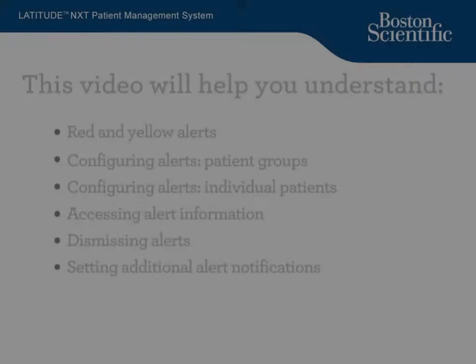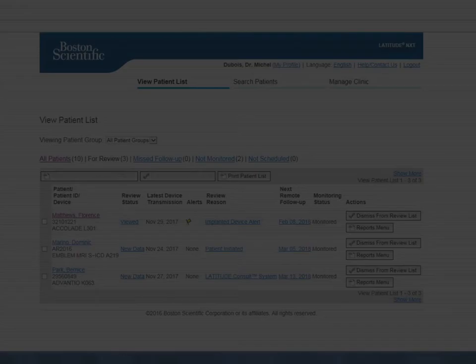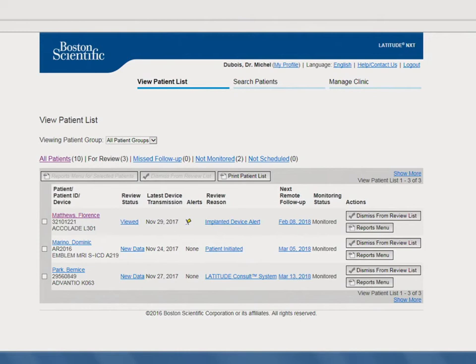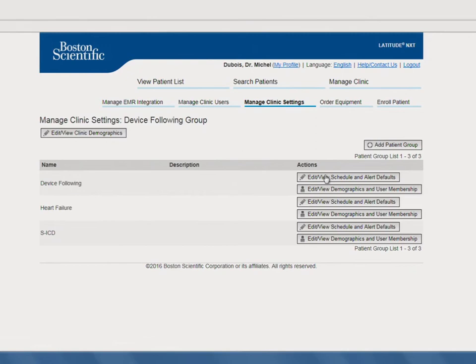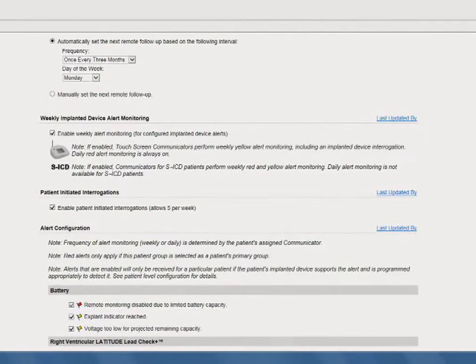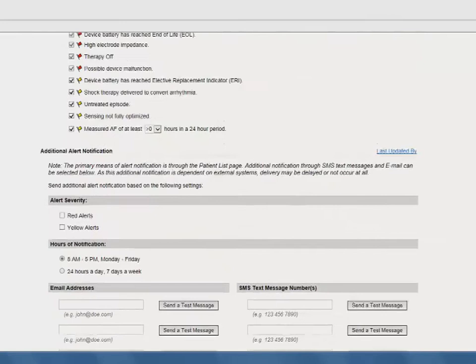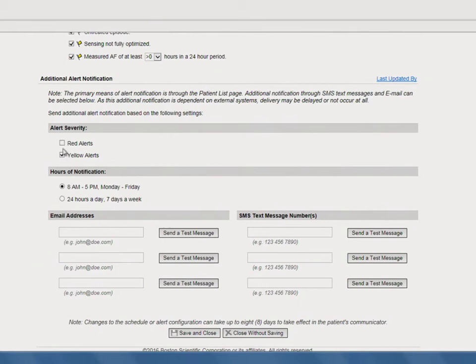Finally, we'll cover your options for receiving additional alert notifications. While your primary alert notifications are available through the View Patient List within the Latitude Next website, we provide you with the option of receiving additional alert notifications through either SMS text message or email. To configure, hover over Manage Clinic and click on Manage Clinic Settings. Click Edit View Schedule and Alert Defaults next to the appropriate patient group. First, determine the alert severity types you want to receive additional notifications for: red alerts, yellow alerts, or both. Next, indicate if you want to receive these notifications between 8 a.m. and 5 p.m. Monday through Friday, or 24 hours a day, 7 days a week. Finally, determine if you want to receive the information via SMS text, email, or both.